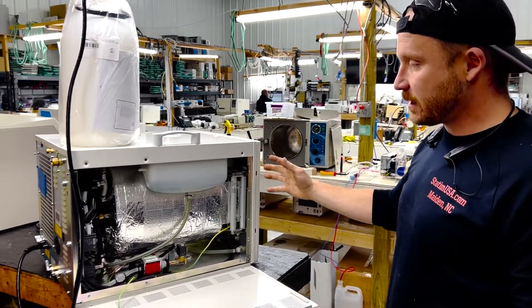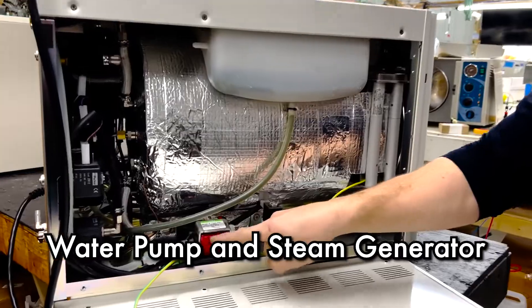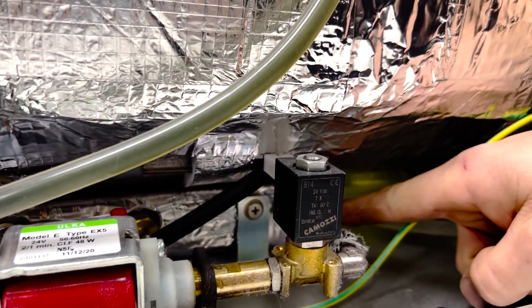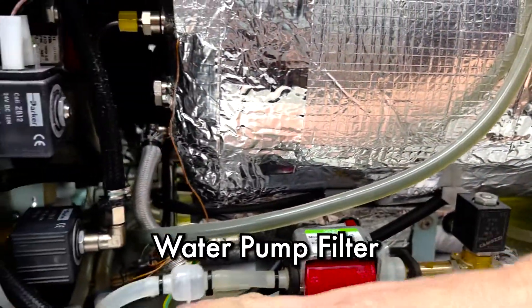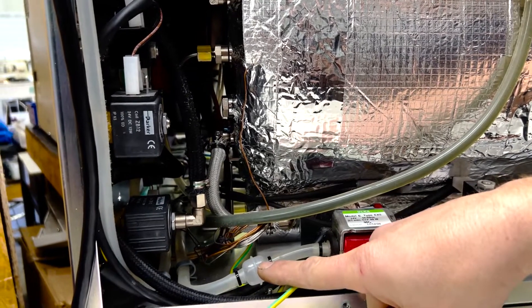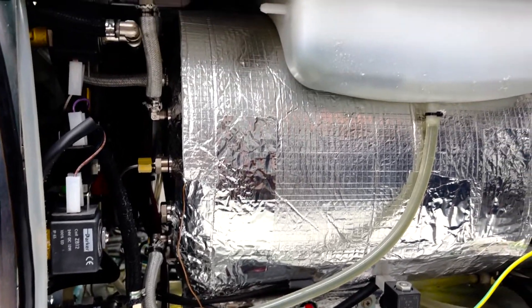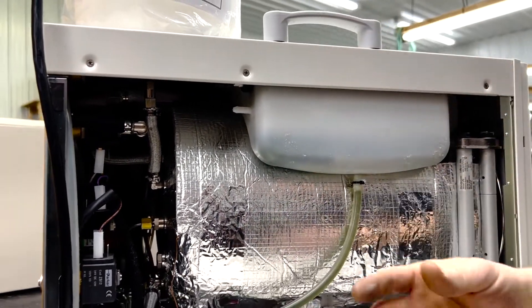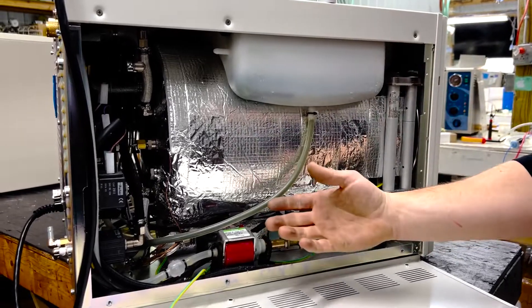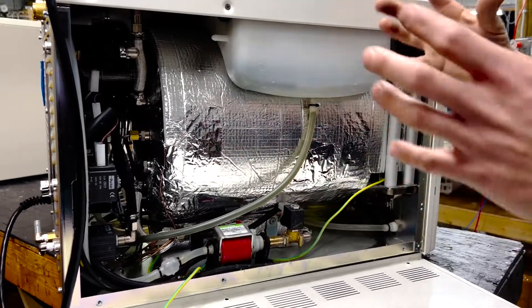These things are really nice units. Let me show you a couple more components. This is the boiler water pump, and then this is the boiler or steam generator down in here. This is also a preventative maintenance item — this is a filter for the water pump. A lot of times what we find is that this is clogged. That is because the fresh water tank is underneath this cover — it's dark, it's damp, it's wet — it just breeds biofilm and bacteria. That's why we recommend that if you're not using it, you're draining it. A lot of times this is clogged, causing no water to get in and essentially unable to run the unit.